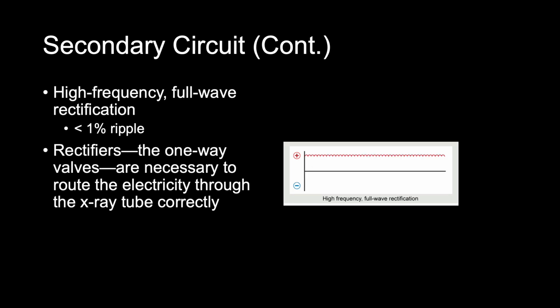The next step in the quest to improve the waveform is the use of a high-frequency generator in place of the standard 60 Hz generators. The standard 60 Hz incoming power is first fully rectified, and then it's sent through a capacitor bank where it is smoothed out, and then from there it passes through an inverter circuit that chops this DC waveform and converts it to the high-frequency alternating current. This low-voltage, high-frequency AC is then passed through a step-up transformer, and it converts it to a high-voltage AC that we use for the X-ray tube.